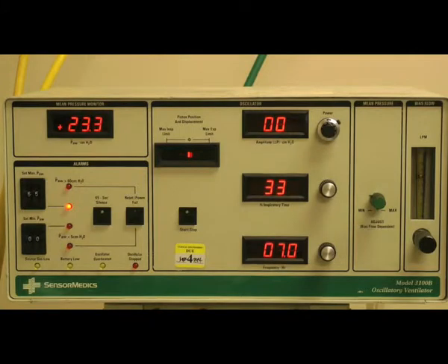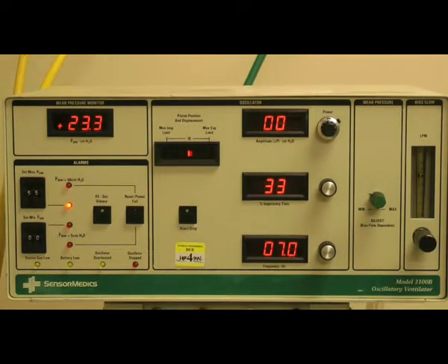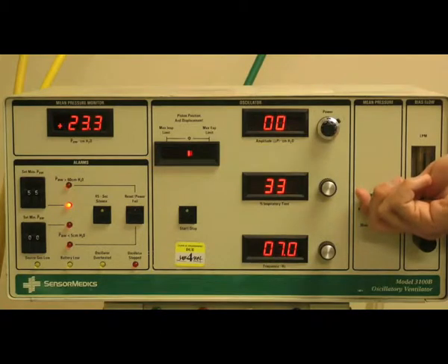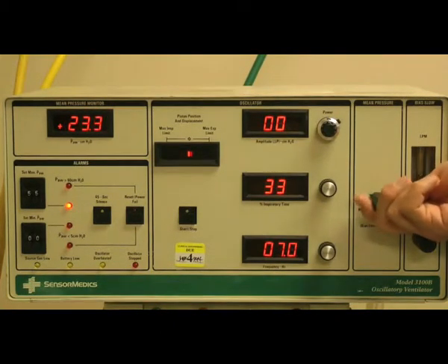After doing your initial recruitment maneuver, you want to determine if your oxygenation is within the goal range, and this will be determined by your SpO2. If your oxygenation is not within your goal range, you can repeat the recruitment maneuver, but you'll need to raise the mean airway pressure to 50 centimeters of water pressure and then reduce it to 36, again over a 45-second period.